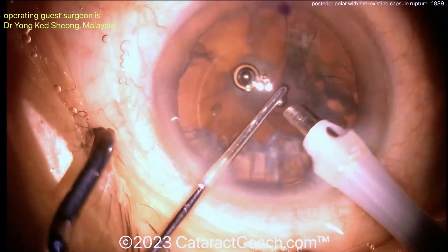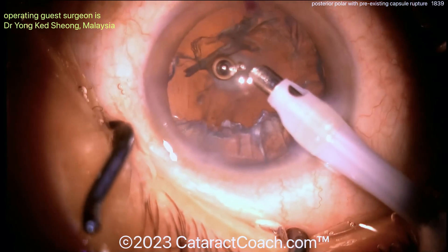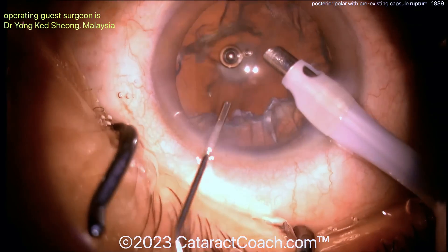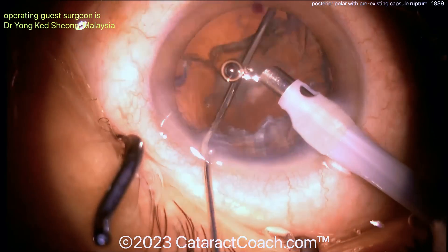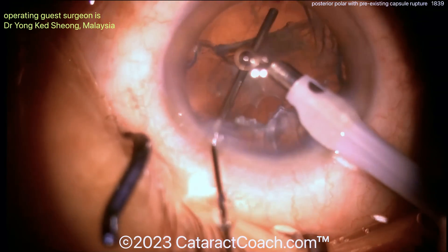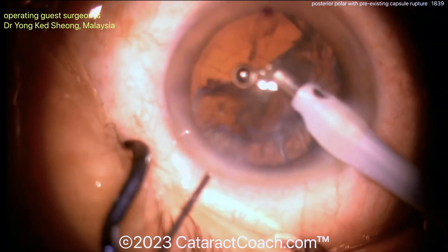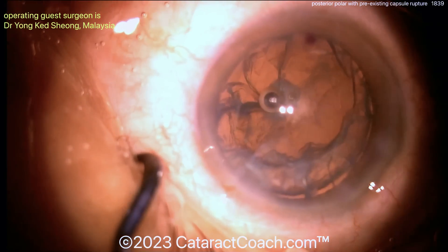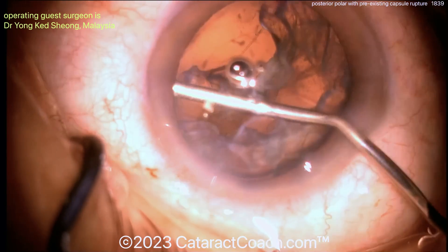Using that chopper to help just lift up the pieces of that epinuclear shell. Be cautious here — don't let the AC collapse. Such smart use of viscoelastic in this case. I really have to applaud the surgeon here. More viscoelastic to visco-dissect with the probe in the eye too — fantastic. The visco-dissection there with a dispersive agent is very helpful getting that piece separated off.